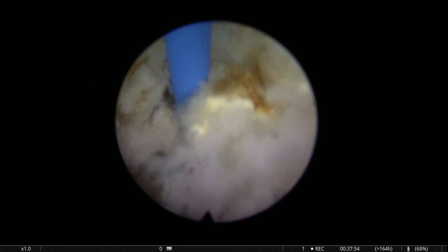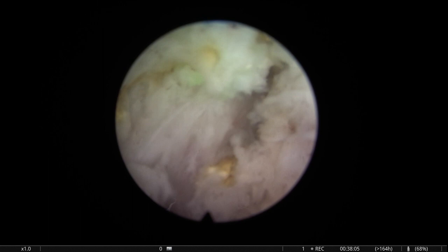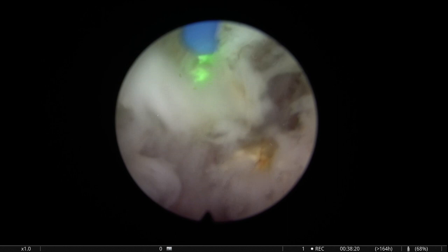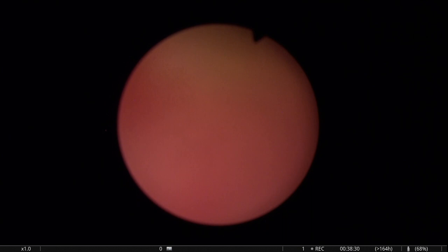So, trimming phase, finalizing phase, making sure that there's no big remaining nodular tissue. If something is already almost dissected but still hanging there, it's probably going to cause the patient some discomfort. Ultimately, it will fall off and he will have to pass it, and he will be very scared if he passes a piece of tissue. So I think it's a good idea to check if this happens. But you can see there's a nice fossa, there's reasonable visibility.